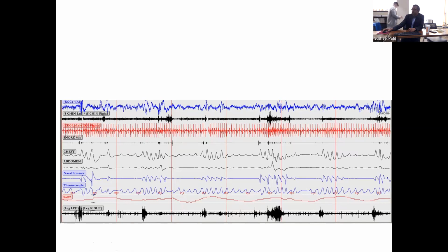Yeah, typically what's going to happen with most disordered breathing events is there's almost always going to be a drop off immediately during the respiratory event, and then there's usually going to be a slow increase throughout the rest of the event. That's sort of the typical thing. Paradoxing, when you see it, it's very specific for obstruction, but you don't always see it.